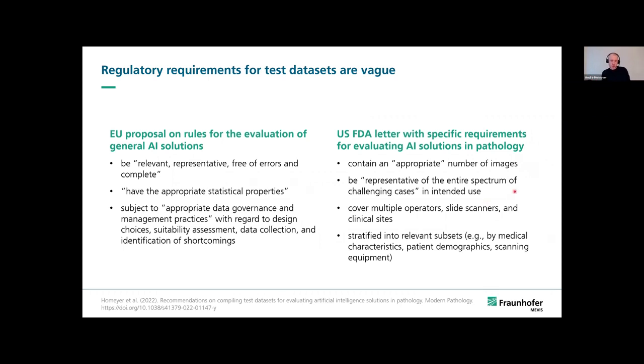It requires them to be representative of the entire spectrum of challenging cases in its intended use. They should cover multiple operators, slide scanners, and clinical sites, and they should be, that's interesting, stratified into relevant subsets, for example, by medical characteristics, patient demographics, and scanning equipment.